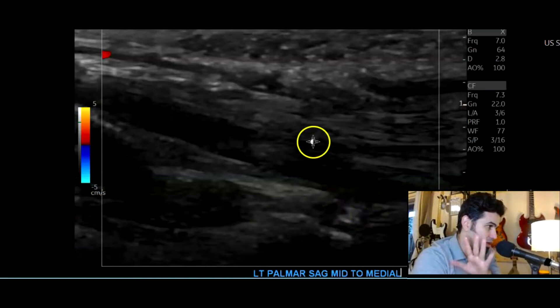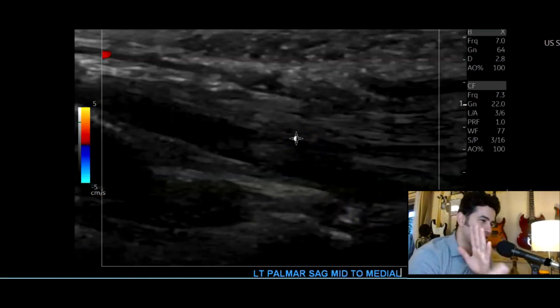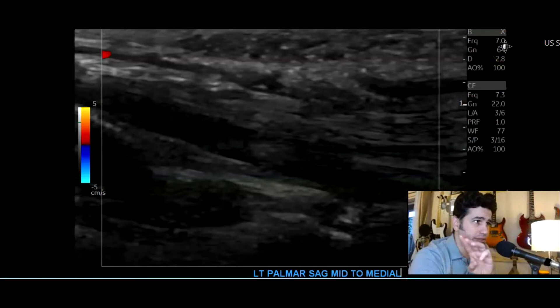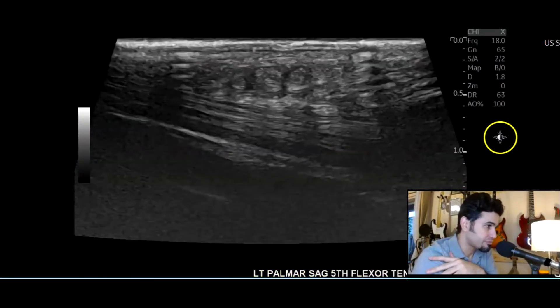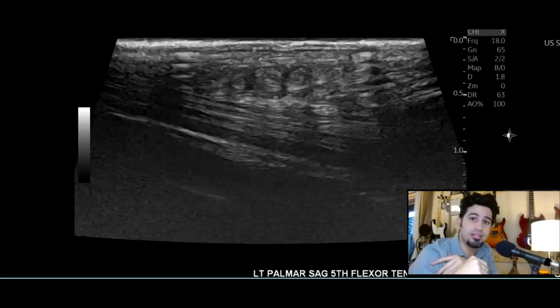It was in the left hand. The patient had a Tegaderm patch, which was obscuring the sound waves a little bit. I started with the linear 9, the linear 15, and the linear 24 megahertz probes. Here's a flexor tendon — not very clear because of the Tegaderm patch.